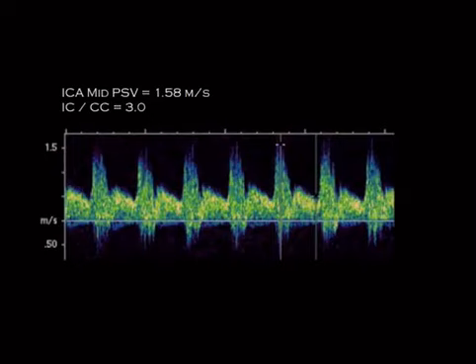Carotid Doppler is something that either you have a lot of experience with or you tend to have no experience with, depending on where you're training in residency. Certain programs dominate this, and they do all of them ad nauseum, where you're doing like 100 of these things a day and you hate them, but at least you know what's going on with them. And then there are certain programs that don't do them at all, that a radiologist has decided to teach a cardiologist or vascular surgeon or somebody else how to do them, because the true specialty of a radiologist is teaching other specialties how to do that radiologist's job.